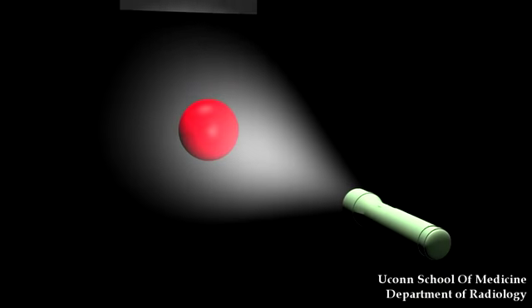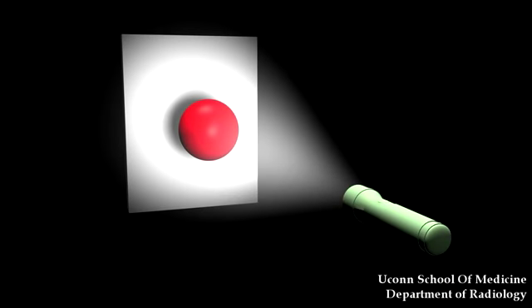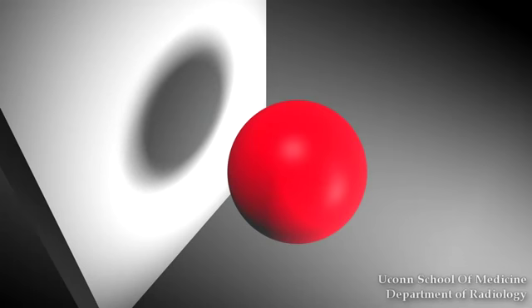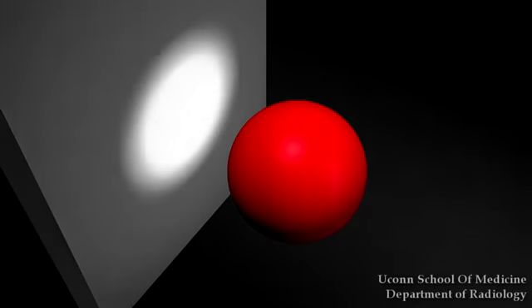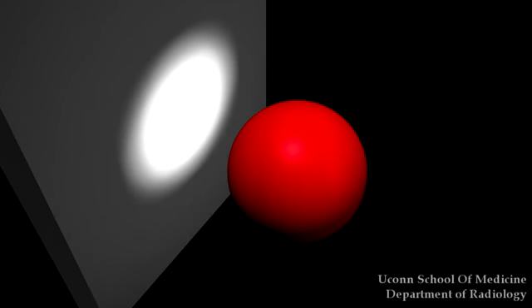X-rays are a form of high-energy radiation produced somewhat analogous to the beam radiating from this flashlight. The object sitting between the source and the image receptor casts a shadow, which is then recorded by the image receptor represented by the white wall. This is what produces the image that is viewed as a radiograph. When thinking about radiographs, it's helpful to imagine that the receptor starts out all white, but when struck with an X-ray, turns black. If a dense object like this metal ball blocks the X-ray, it leaves a white impression within its shadow.